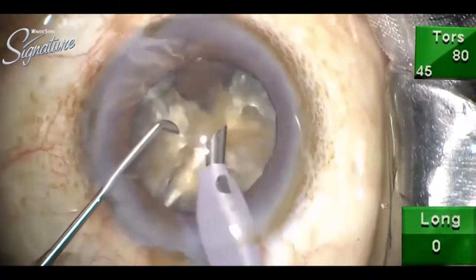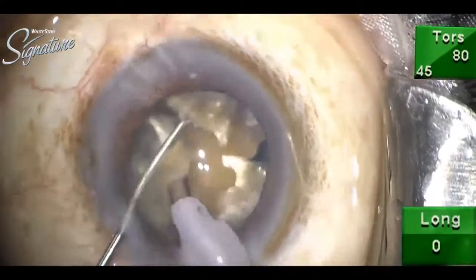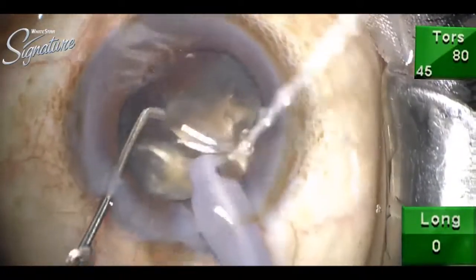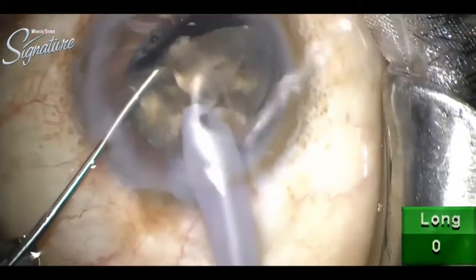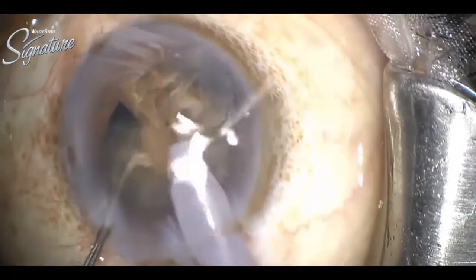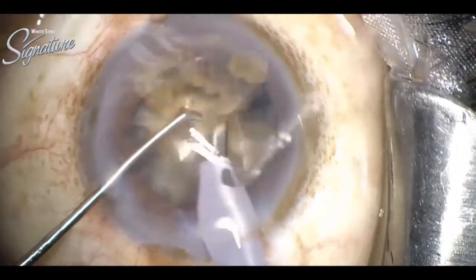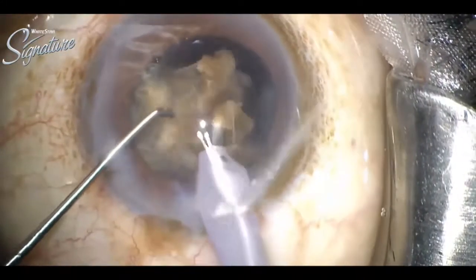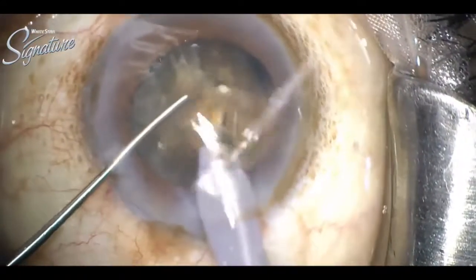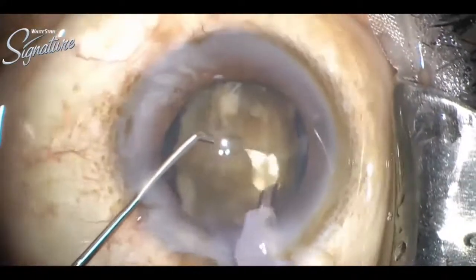The chamber is well maintained. Now the AC is again formed with viscoelastic. It is important to form the AC again and again as we emulsify the nucleus. The probe is at the center, kept sideways, and the followability is good.